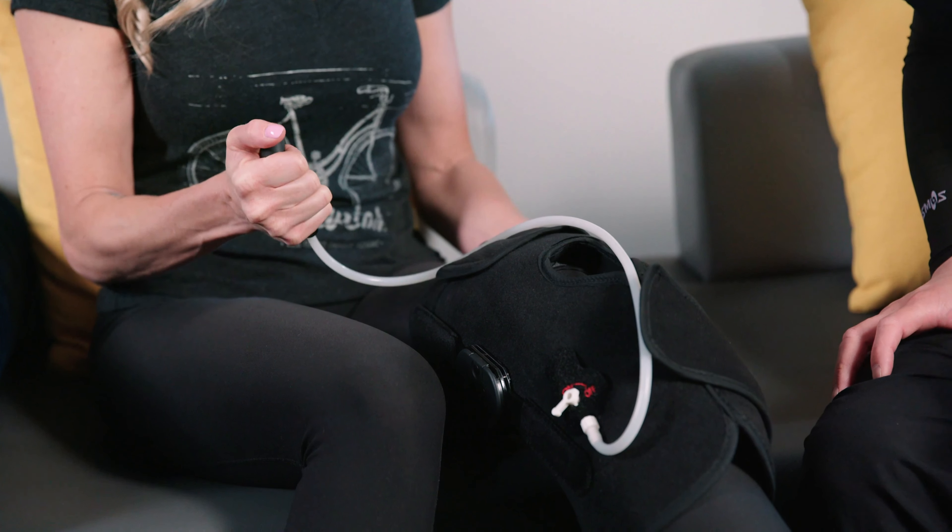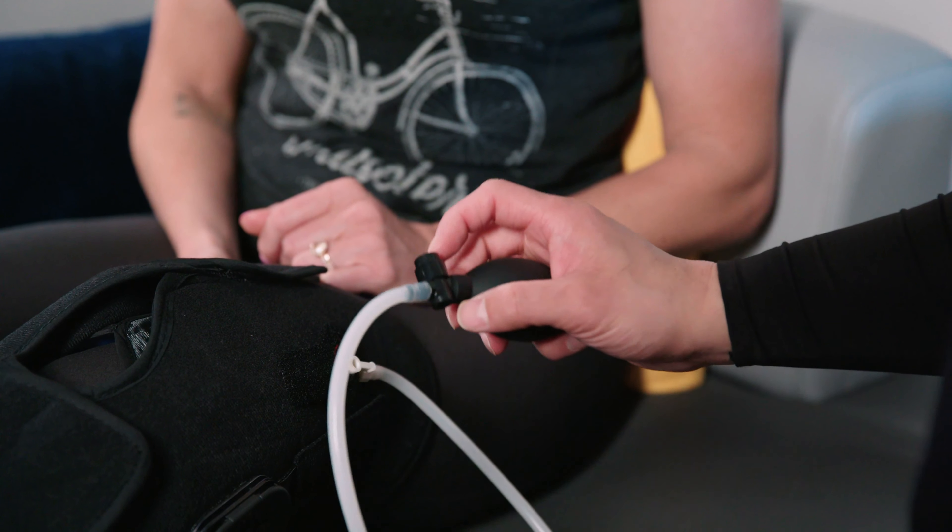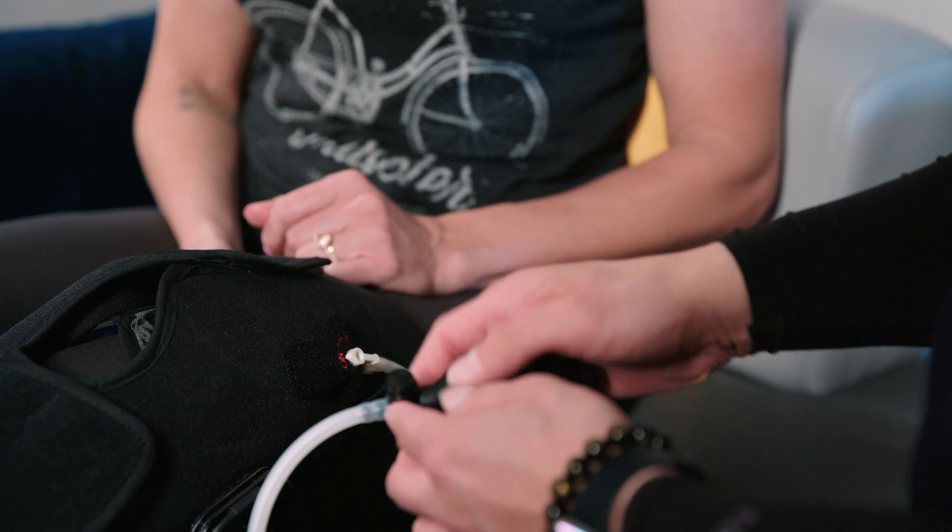Squeeze until you reach a level where you're comfortable. You don't want it too tight where it's causing you discomfort. There's a little button that releases the air — you push that down and that releases the air.